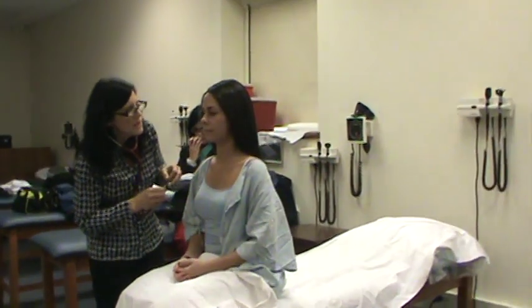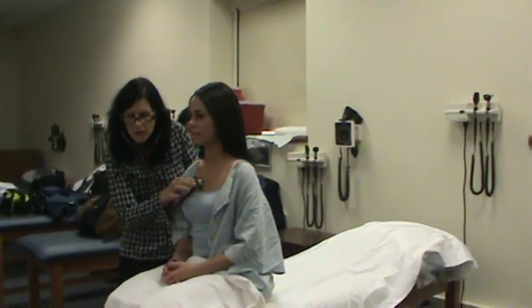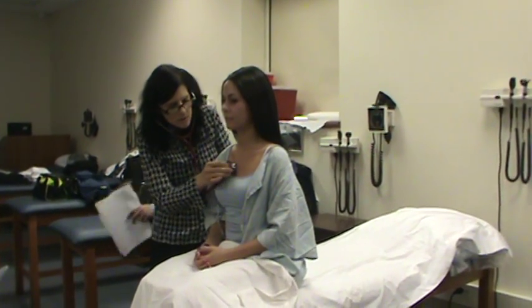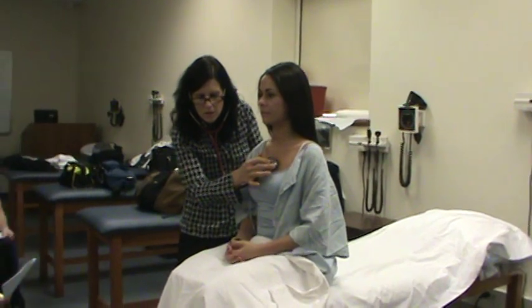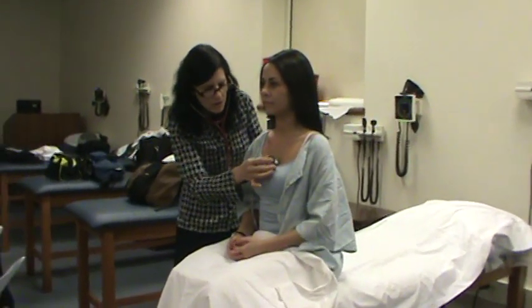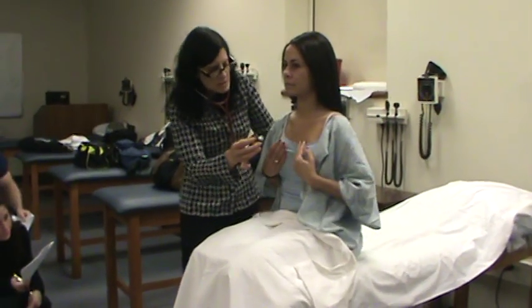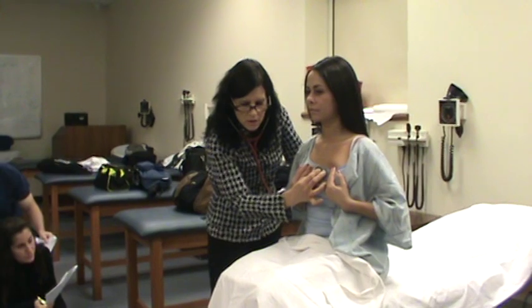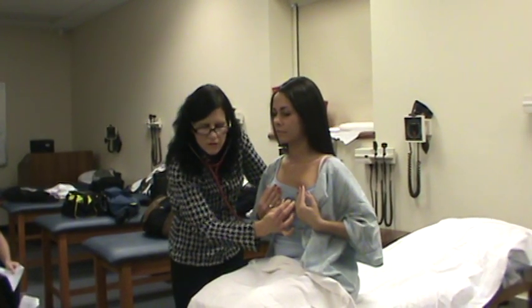I'm going to turn this around and listen with the other side of my stethoscope — the bell. Again, second intercostal space on the right, aortic. Second intercostal space on the left, pulmonic. Third, Erb's. Can I ask you to move your breasts? Fourth, tricuspid. And then right about in the mid-clavicular line, the fifth — the mitral.